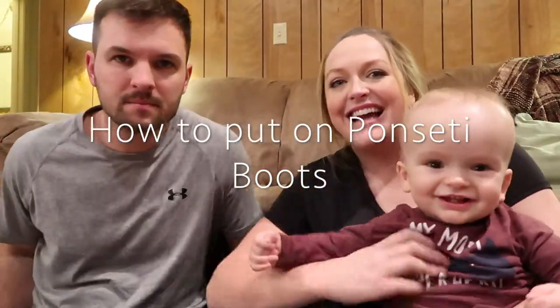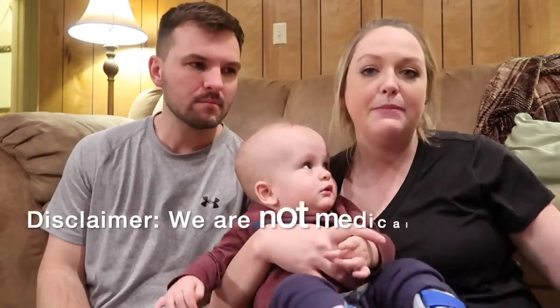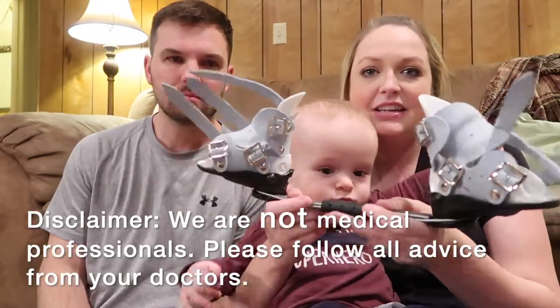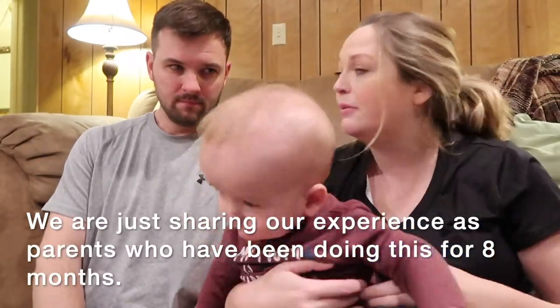Hey guys, we're Justin and Alicia, and today we have kind of a different video for you. We are going to show you how to put on the Ponsetti boots and bar. It's a different kind of video for us, but one that we wish we had had when Isaiah first got his boots and bars.